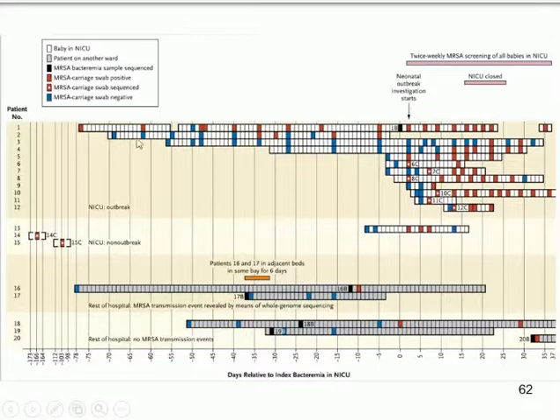And the colour coding, this is just doing a swab, so they just take something like a little tip, swab the skin of the baby, spread it out on an agar plate, just as you were doing a couple of days ago, and look and see whether there's staph growing and see if it's methicillin resistant or not. In the cases where it's red, the answer is yes, it is resistant. If it's blue, it's not resistant or it's not growing.